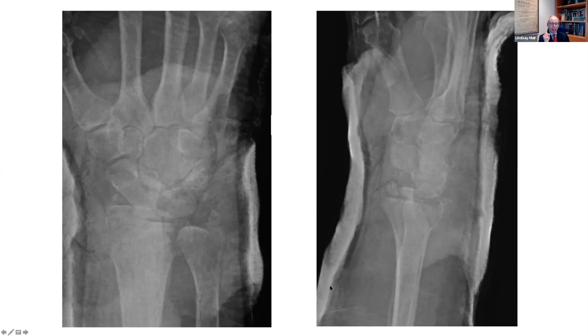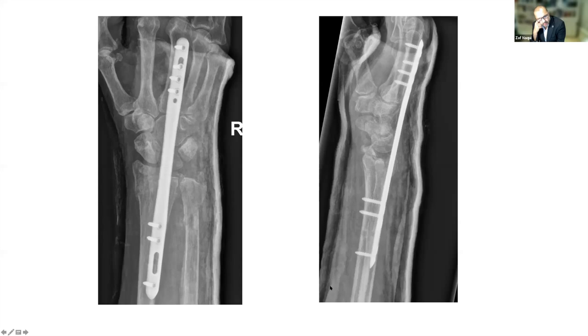And I guess they're more prone to infection, and the buried plate, the spanning plate, gives you some push down. It makes it easier to get the X-rays and you can leave it in for a longer period. But effectively, they are doing the same thing, aren't they? They are spanning across the wrist. So here we go. Lisa, do you want to talk us through this?